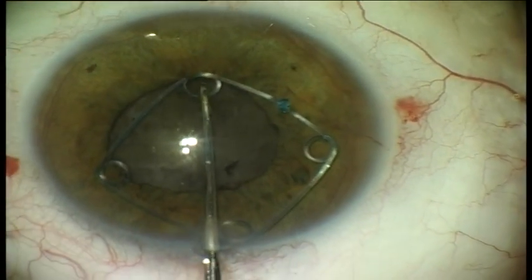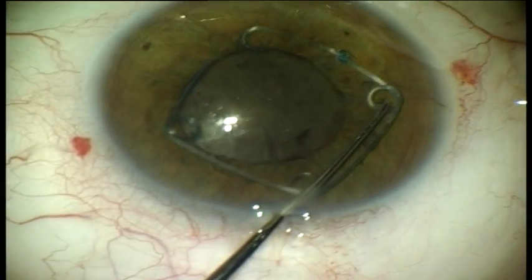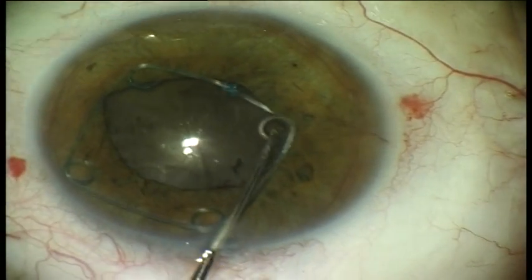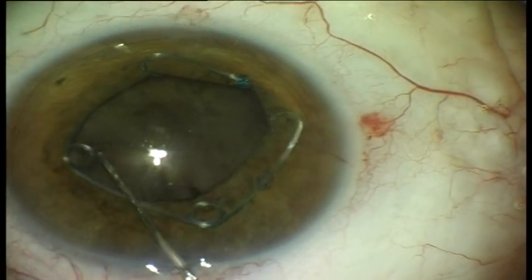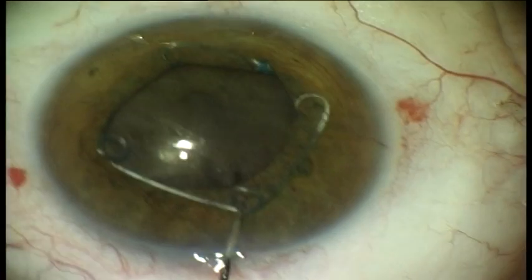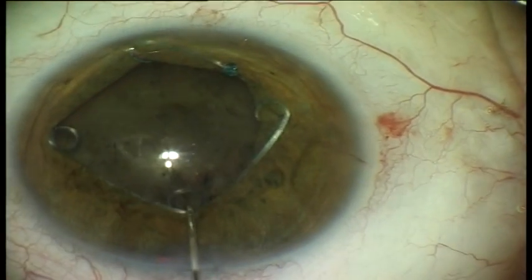The insertion is carried out through the main incision or paracentesis with the help of a Sinski hook. The pupil expander is positioned centrally and gently pushed at each angle to trap the iris in the four loops. The result is a finely dilated pupil and good exposure of the anterior portion of the lens that facilitates subsequent manipulations.